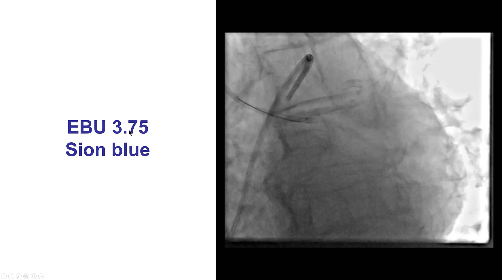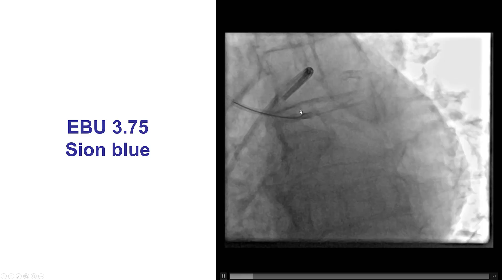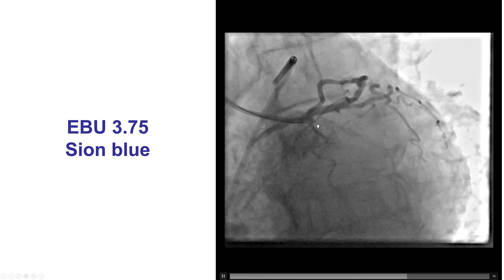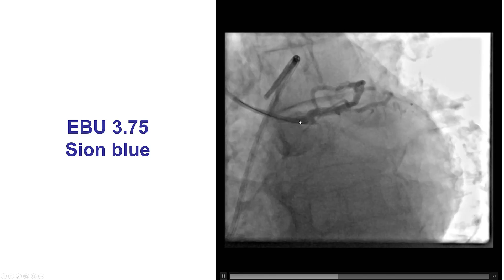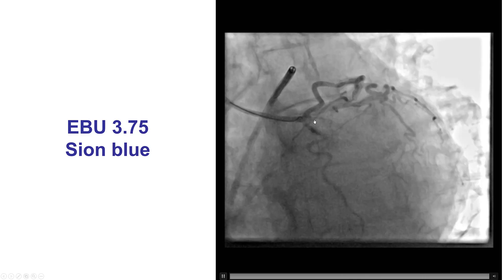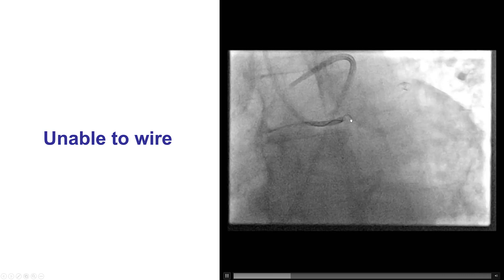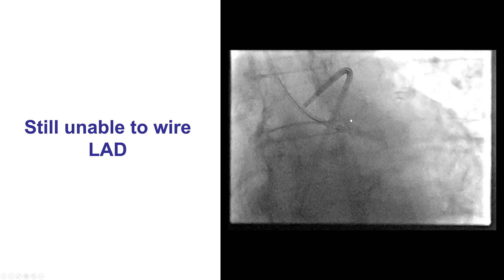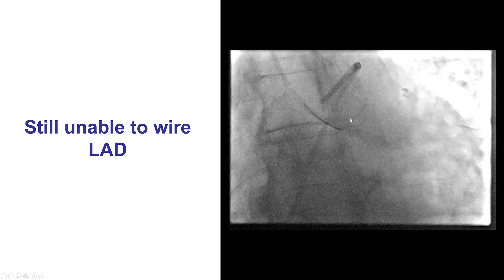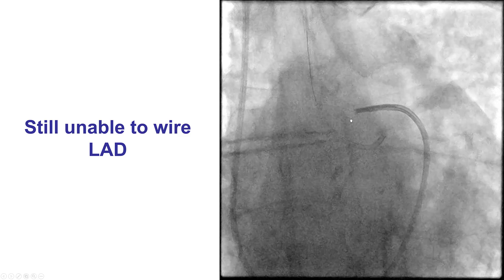We used an EBU-375 guide catheter and a workhorse wire in attempts to wire into the LAD. However, wiring was actually challenging. We had a hard time advancing the wire into the LAD. The guide was sub-selectively engaging into the circumflex, so we were unable to advance the guide wire. This was a soft guide wire. We switched to a smaller guide catheter — an EBU-35 — but still had difficulty advancing the guide wire into the LAD.